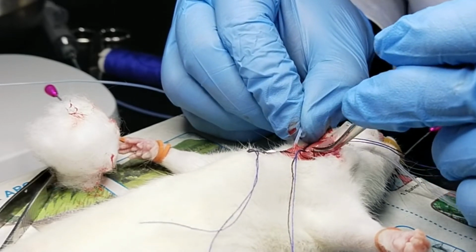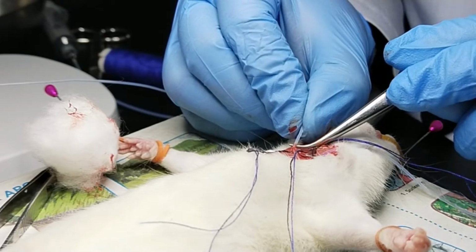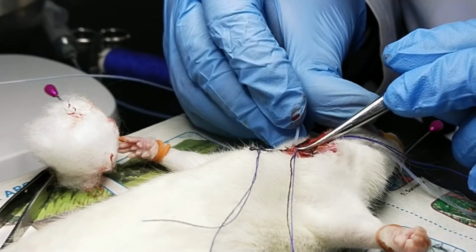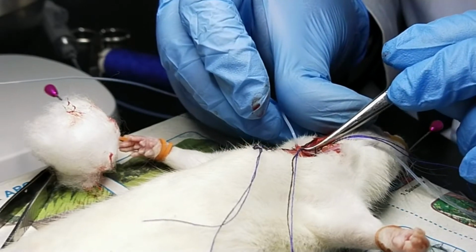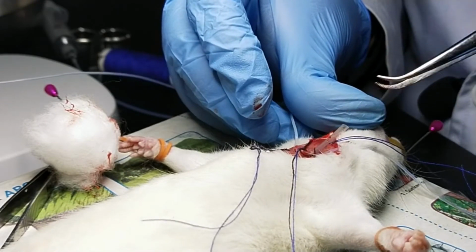Okay, the tube has gone in. Now we need to tie on top of the tip, on top of the cannula.